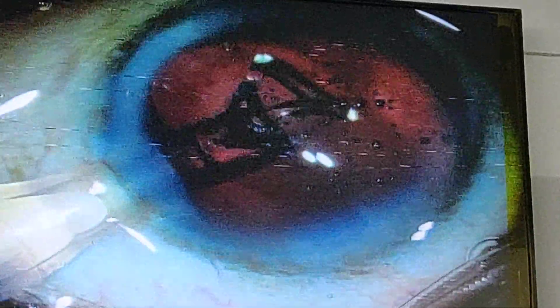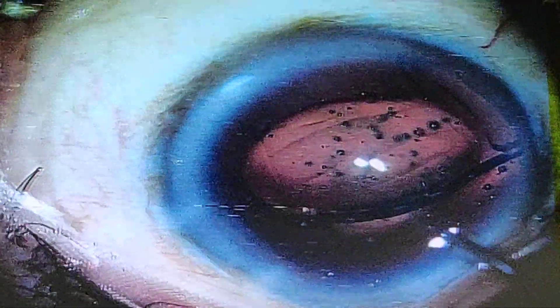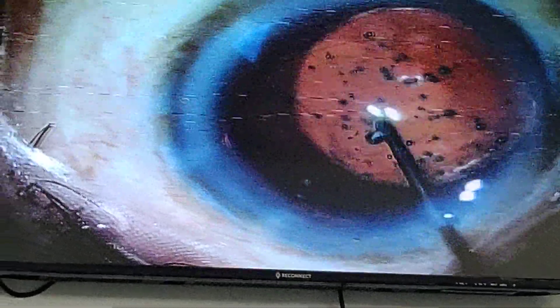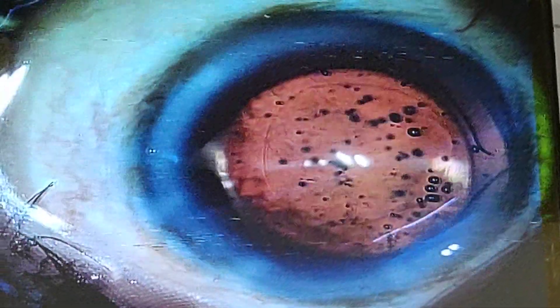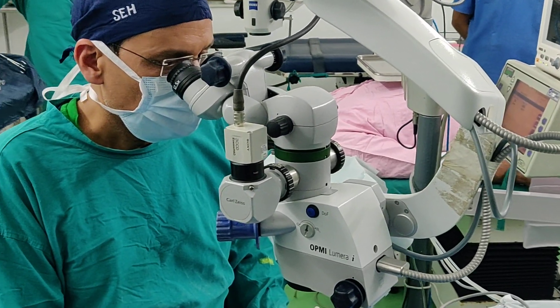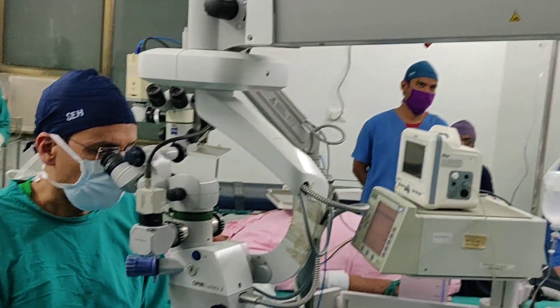We are going to insert the lens now. You can see how nicely the lens is coming through, and this is the perfect centration of the lens. This is the intraocular lens now placed inside the eye. I am removing the viscoelastic, and you can see I am removing the viscoelastic from behind the lens.